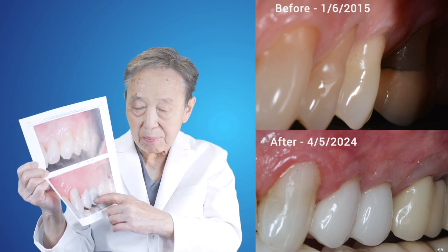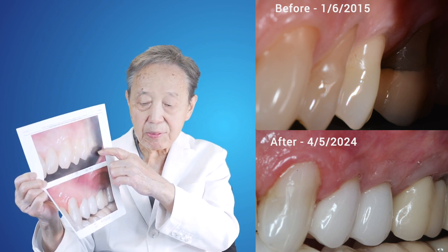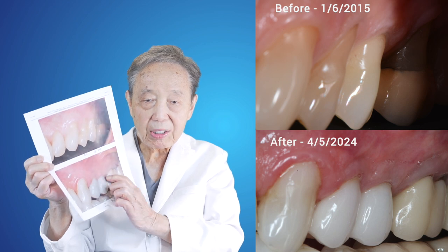Look at the long bicuspids — now they're much shorter. Look at the molar here: seven millimeter recession. Now, nine years later, it is in a normal position with keratinized tissue.